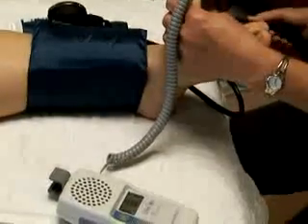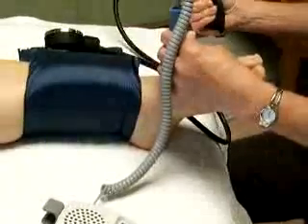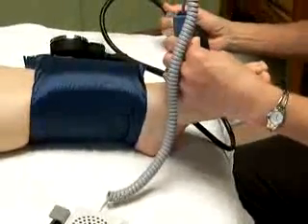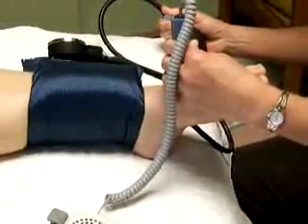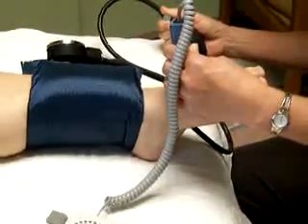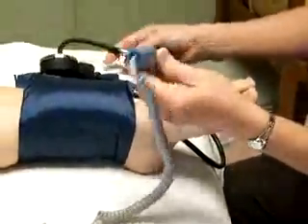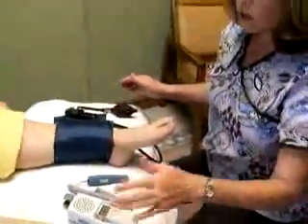And then you inflate the blood pressure cuff to the point where you obliterate the sound, and then the first sound you hear is your ankle pressure. So then, if you don't have a chart, you just divide the ankle pressure by the brachial pressure to get your result, a normal result being 1.0.